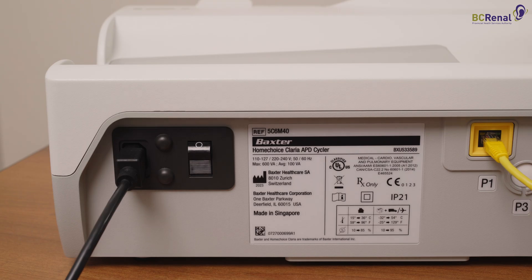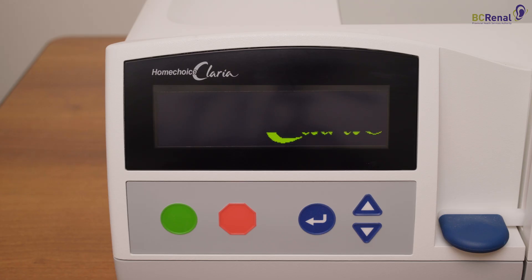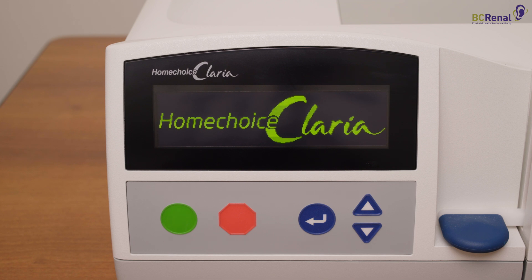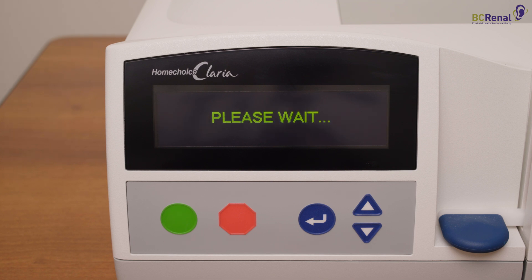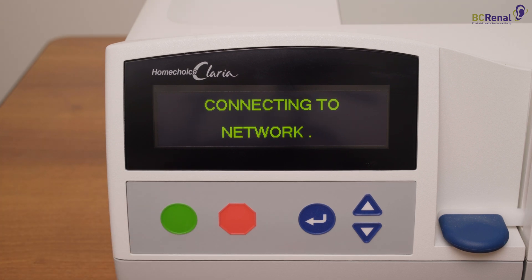Turn on the Cycler. The on-off switch is found on the back of the Cycler. The Cycler's display screen will light up and the Home Choice Claria logo will appear. Once the Cycler is turned on, your name will appear on the screen. Press the green button when you see your name. The message 'connecting to network' will appear on the screen, which indicates that the Cycler is connected to the ShareSource platform.